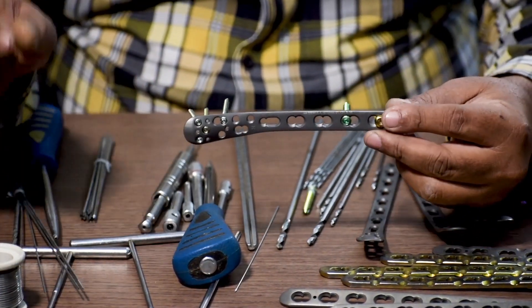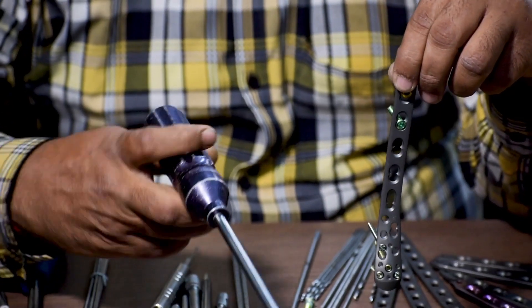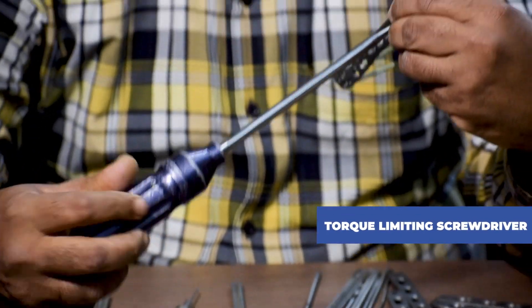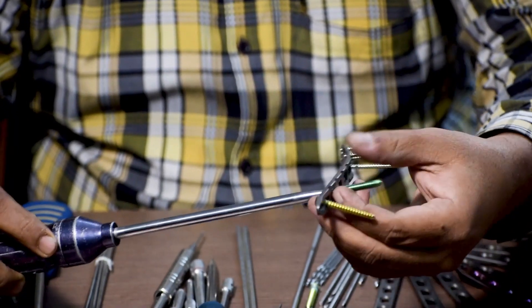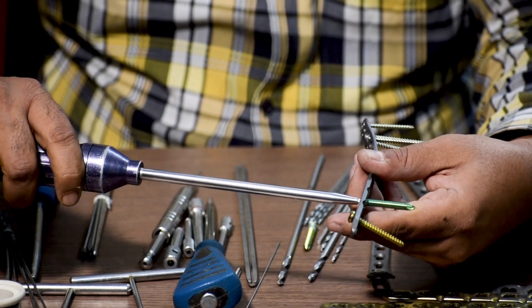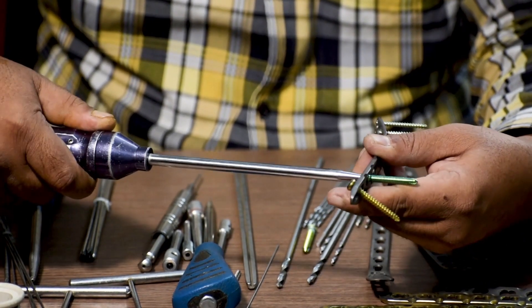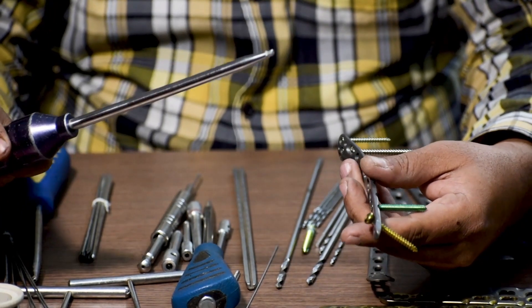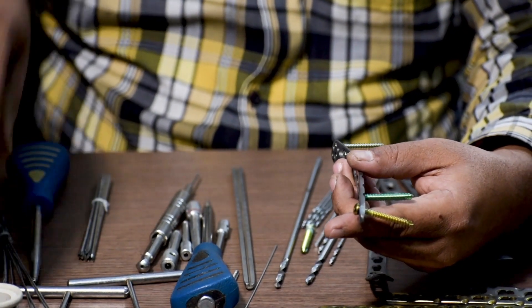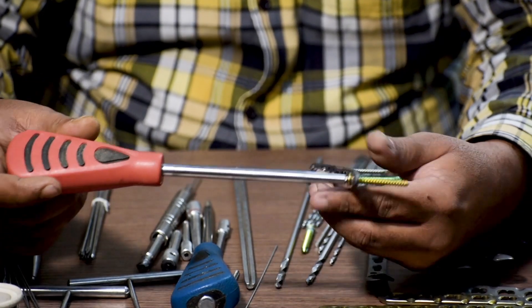Once the entire fixation is done, we will use a torque limiting screwdriver to make sure all the locking screws are locked properly. When you fix the head of the screwdriver with the locking screw and start rotating it, it creates a click sound when locked completely. This click sound means the screw is completely locked and we will not tighten it further. For non-locking screws, no torque limiting screwdriver is used — these are fixed manually with a regular screwdriver.